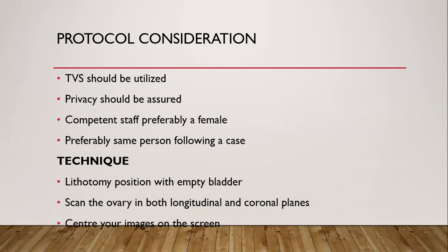Your probe is going to be closer to the region of interest. As a result, you are going to have better visualization. You're going to have a more clear image, and you'll be able to see the ovaries more clearly than you would have seen them on transabdominal.